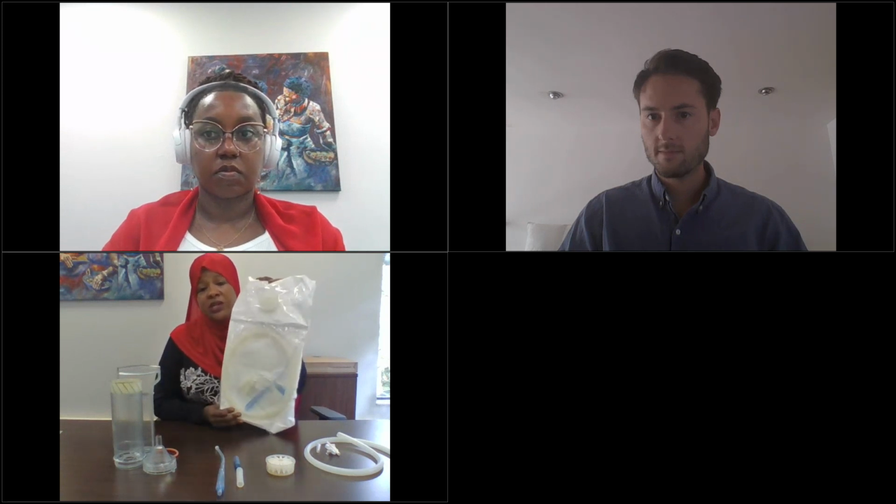So on my table, I have the device laid down. When you buy this device, it comes with a reusable pump, which is decontaminated and sterilized by autoclaving, and can be used up to 25 times. And then what I talked about, the filter and the accessory kits. The accessory kits come as an inlet and outlet accessory, already pre-packed and sterile, and can be used as a single-use device.